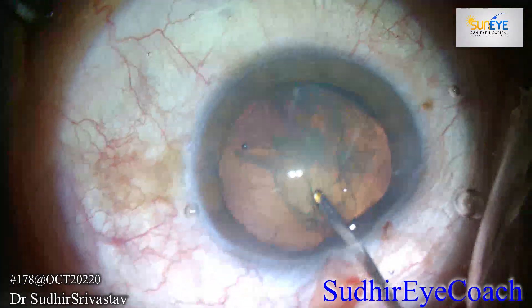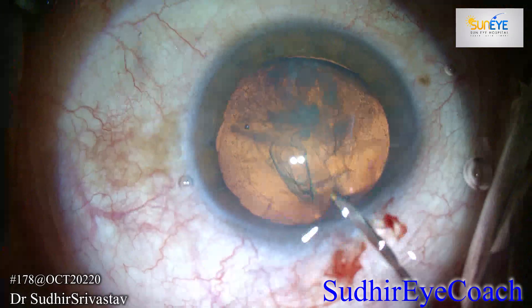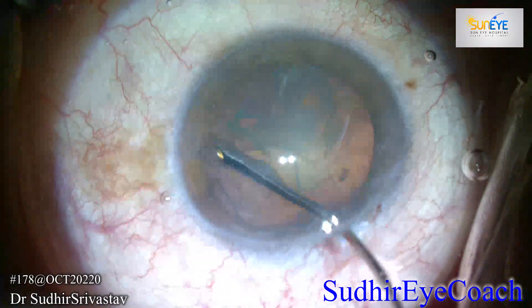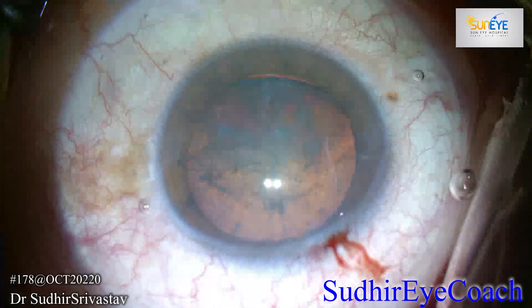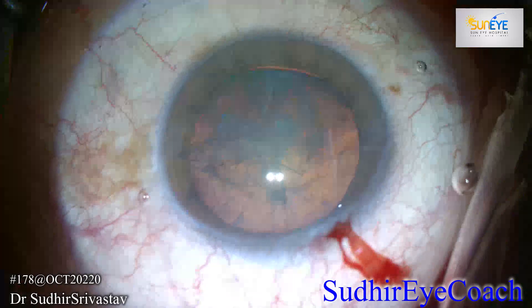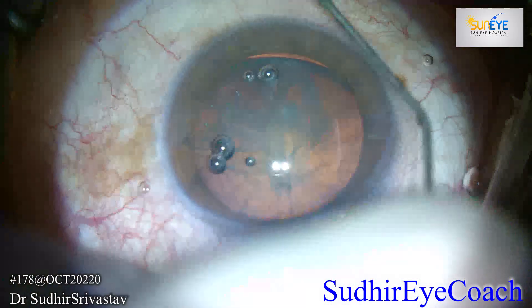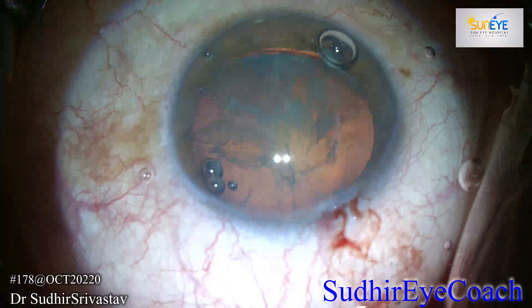Here I kept an endocapsular ring and Cionni's ring in advance, and a variety of IOLs — iris claw IOL and IOL for scleral fixation, that is the multi-piece IOL — in advance. Always assess the pressure of the globe; it is very important. Plan your surgery under proper local anesthesia, as local anesthesia will give you more confidence and the patient will remain comfortable during the procedure.